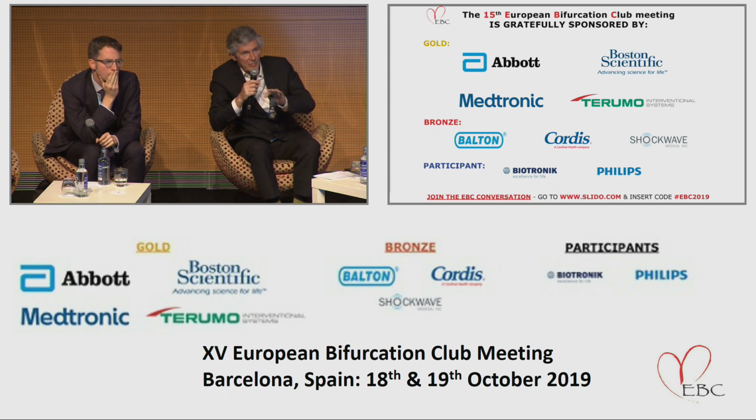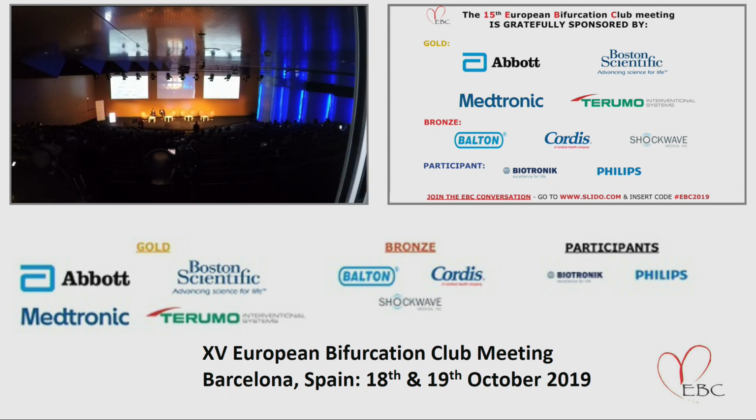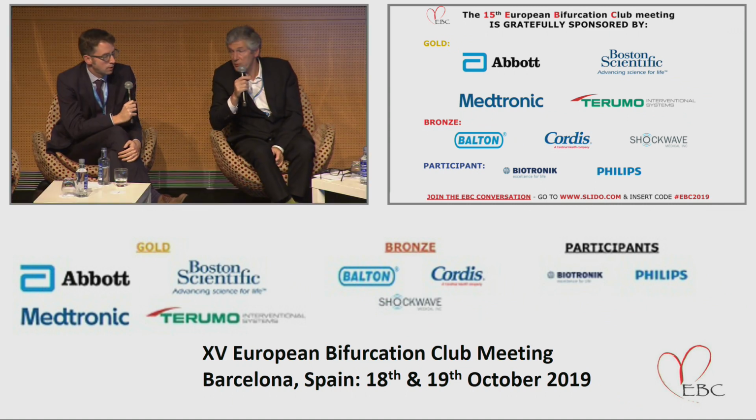I think there is possibly another mechanism of this problem, but it is very difficult to analyze. In this case, probably we'll have to do a guided optimization on what was done and maybe add another stent to treat, because at the end, in the last image that we have seen, there was no stent in the left main, just one part of the stent somewhere. Any comment in the room?